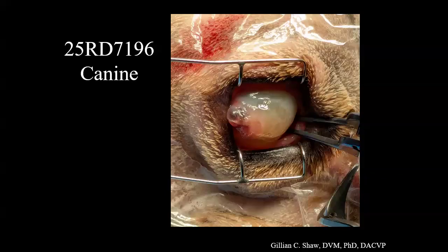So I'm going to withhold the rest of the history because it's really interesting. But anyway, so we got the globe, and I mean, this is the clinical photo, so that's that lateral area of perforation.